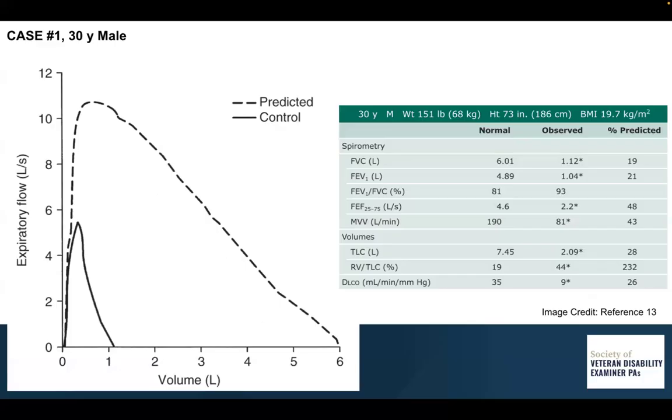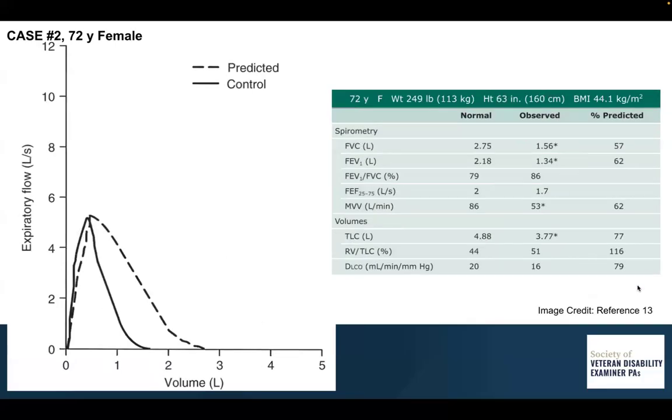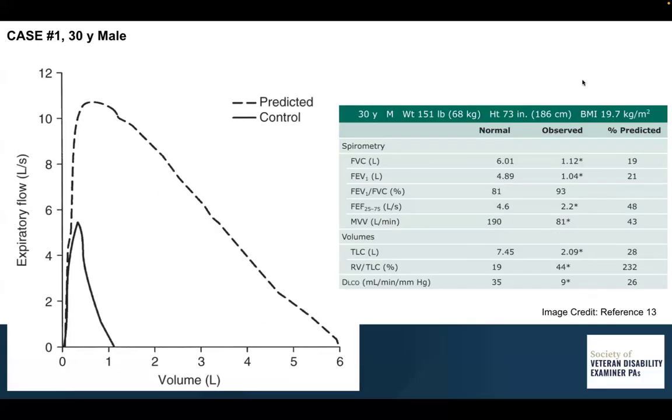You would expect with this patient, the oxygen saturation, if it's normal at rest, to decrease with exertion. But restriction is predominant. You could say there's also maybe an obstructive component, but restriction, especially with the low DLCO. So again, just highlighting the importance of DLCO in this one.